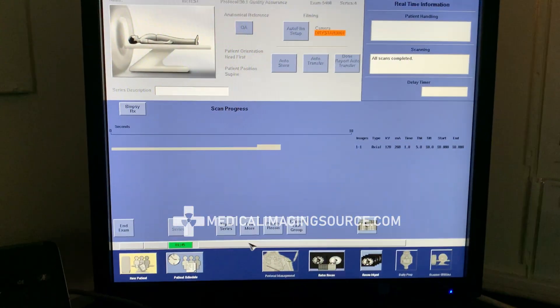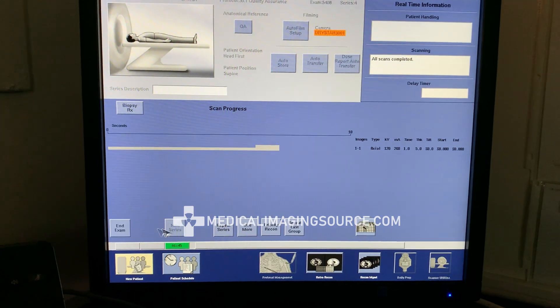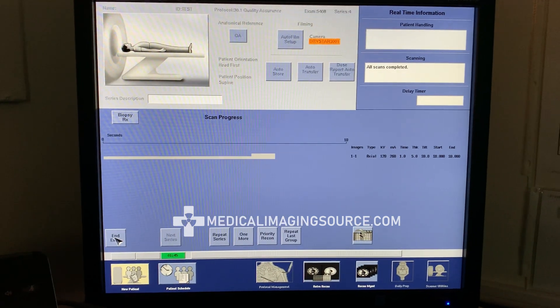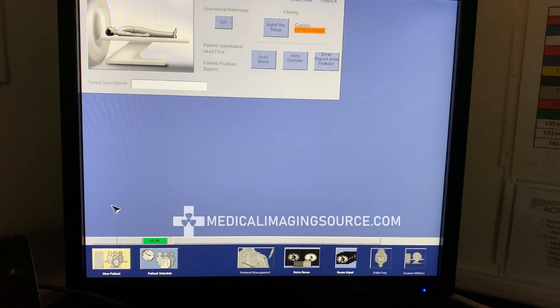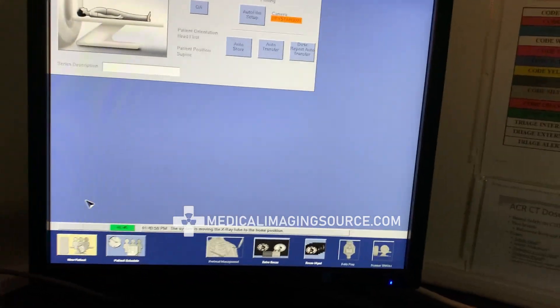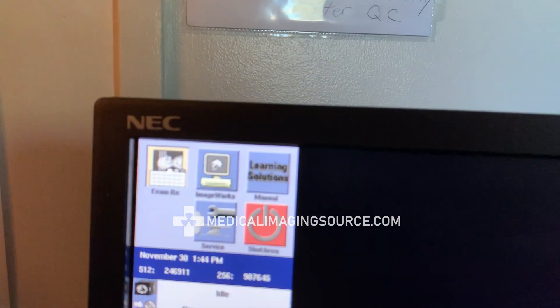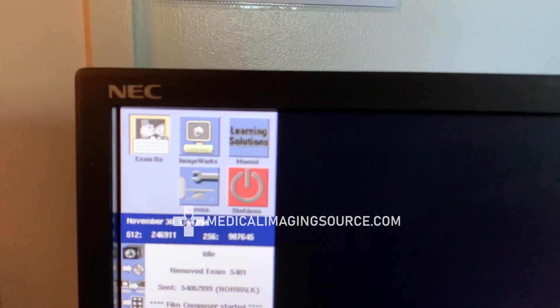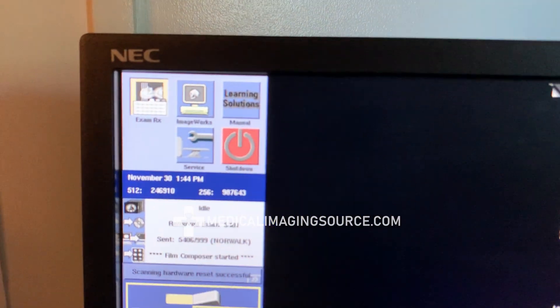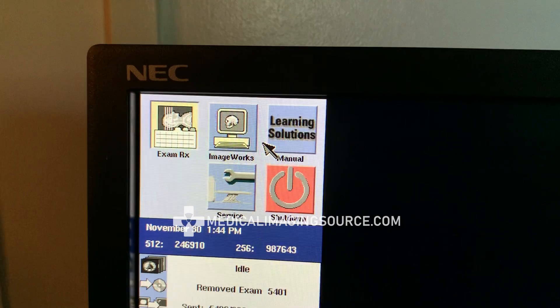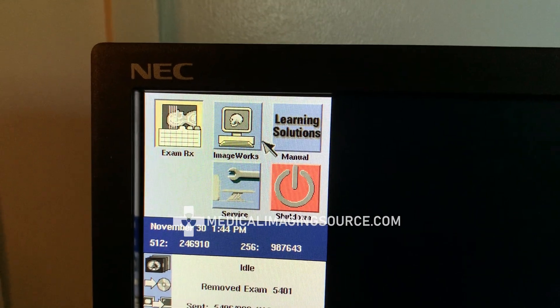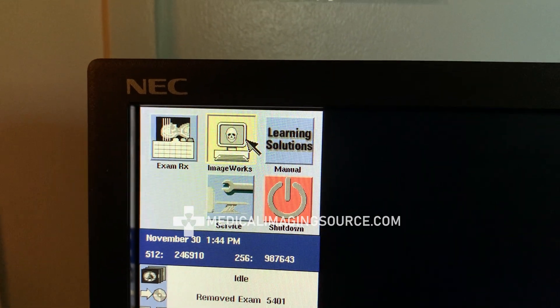All right, images look good and we're done with our exam here, so we can click on End Exam. I'm going to do my best not to violate any HIPAA rules here, so we're going to click on ImageWorks, keeping it nice and zoomed in.